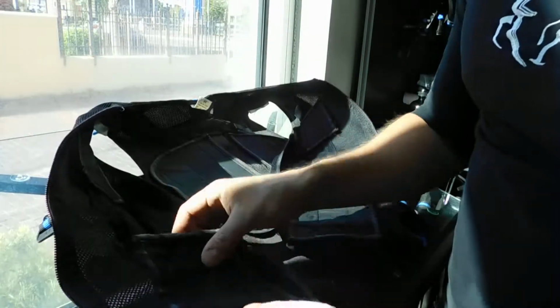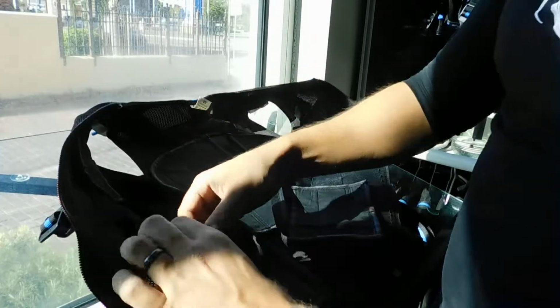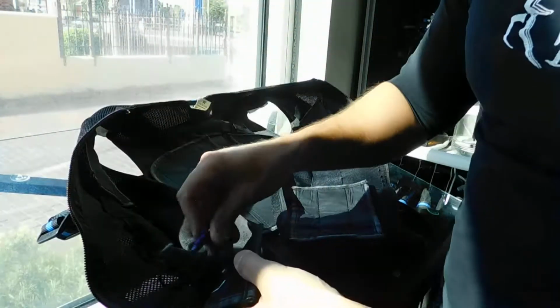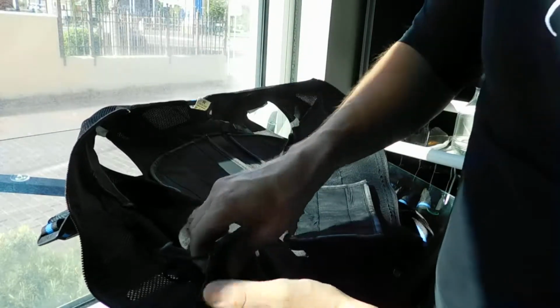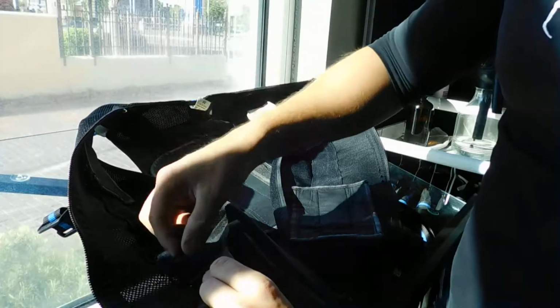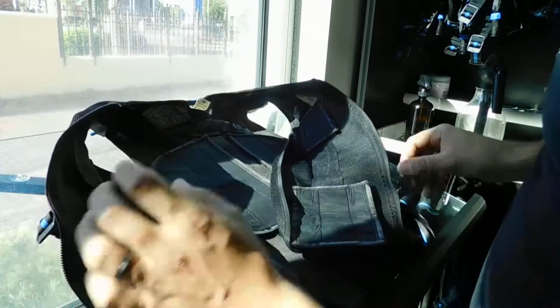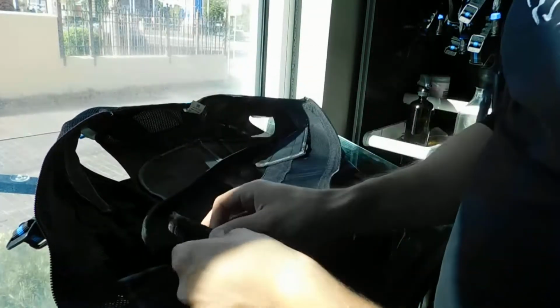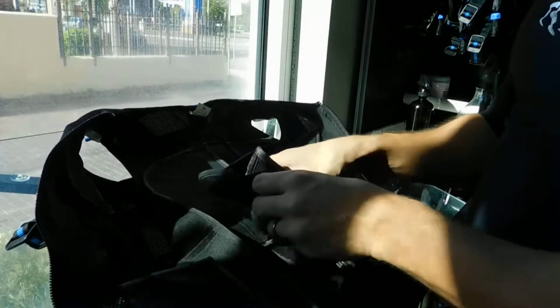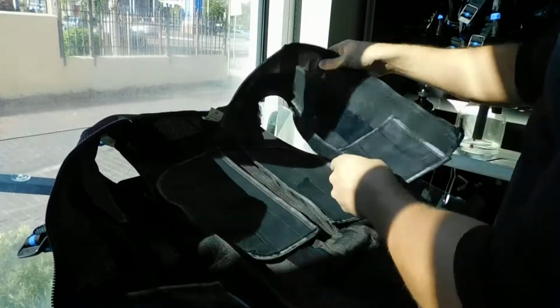Put it down really nicely, and then this is not good. There's a pressure here. So this needs to be fixed. You can easily take this off, turn this around, make sure you put it down right, and then you push it back on. And it clicks. And this is fine. See, this right here is fine because there's no pressure on it. So you can just put it down here, and this is perfect, good to go. So in most cases, that's the problem. See, this is perfect, so this should be good to go. You should not cut out. There's this little gap. We fix it as much as we can, and then it's good to go.